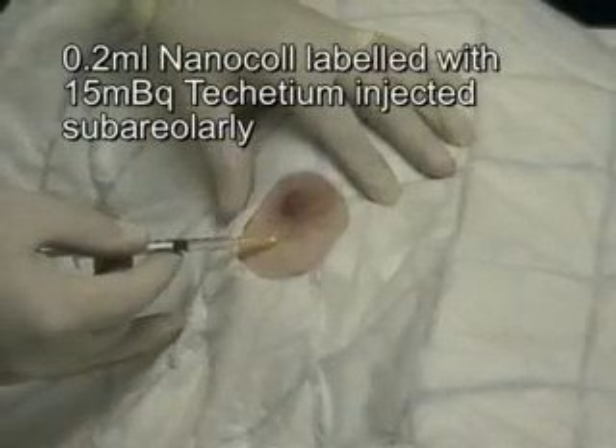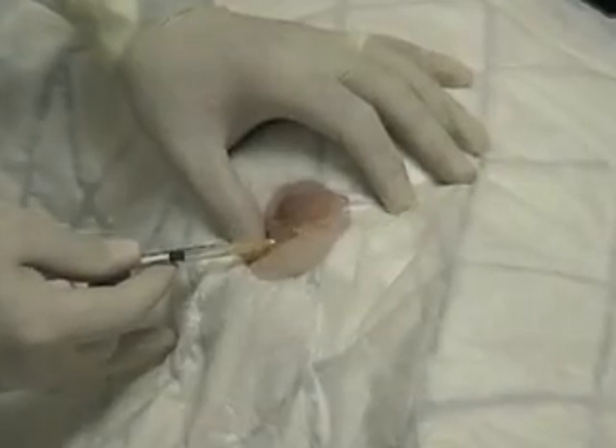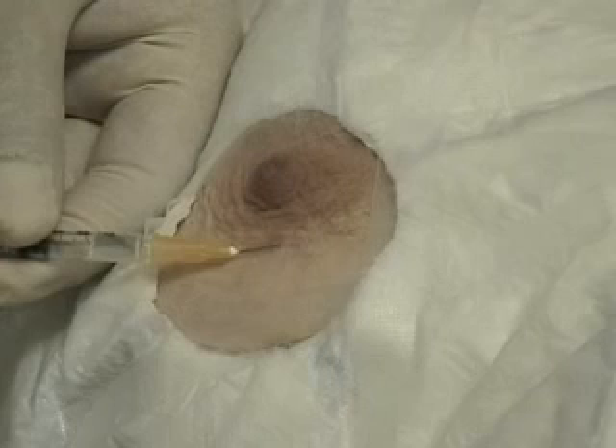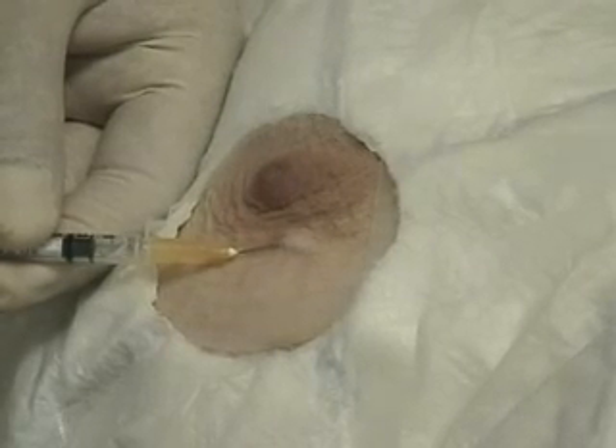After warning the patient, the needle is inserted very superficially into the skin in the periareolar region in the index quadrant. You can be confident that you are injecting superficial enough when you see a bleb raised.